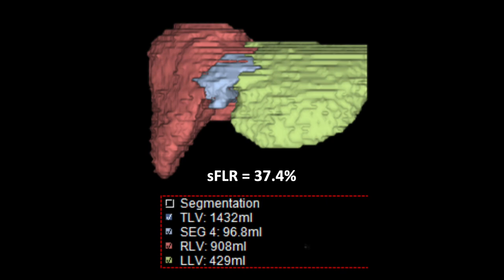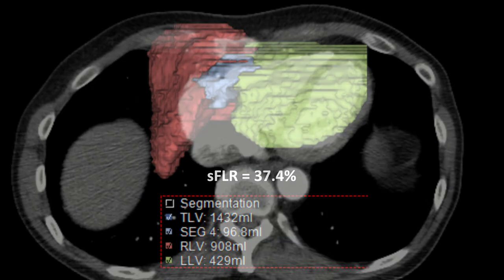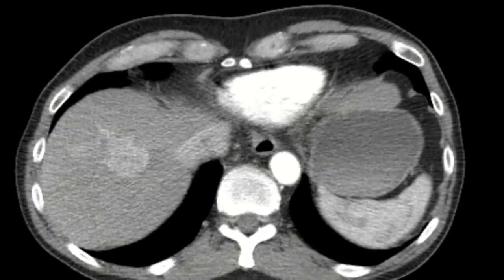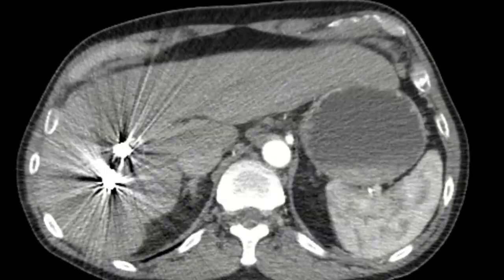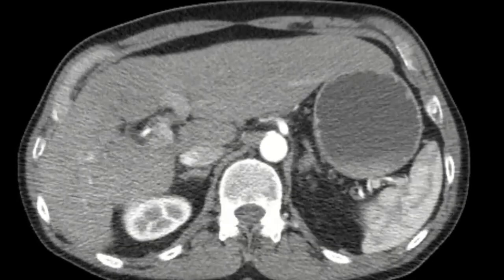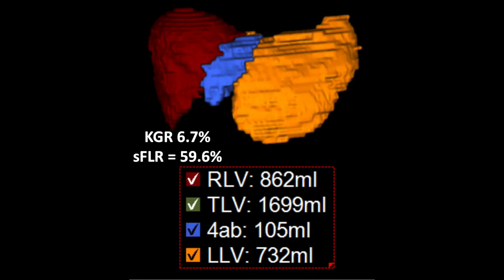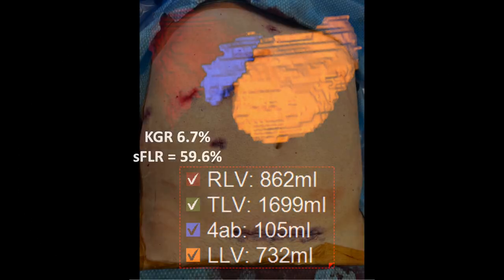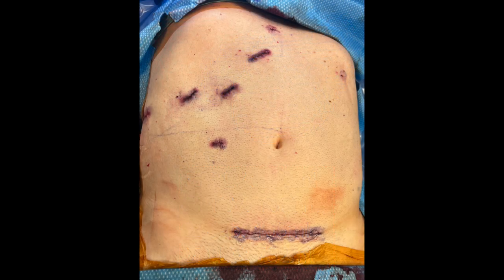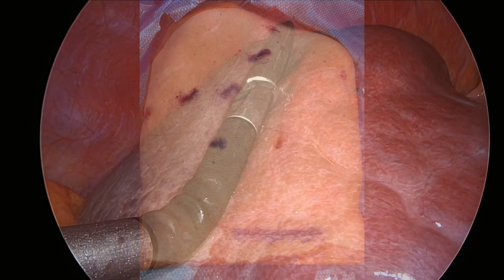With a calculated future liver remnant less than 40%, the patient underwent portal vein embolization with a good response — a kinetic growth rate greater than 2% and a future liver remnant of almost 60%. The patient was positioned in a modified French position with split legs. We used five subcostal working ports and extracted through a Pfannenstiel incision. An additional port was placed inferiorly to help with better angles on the cava.